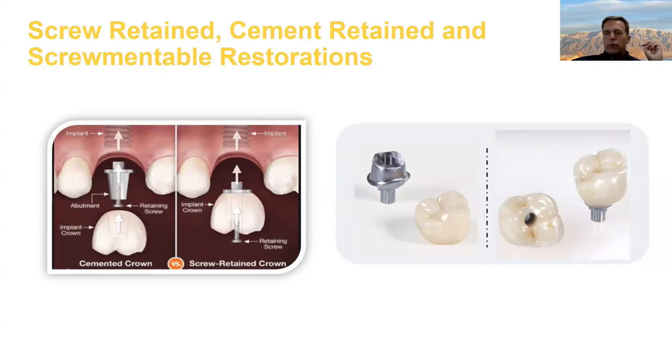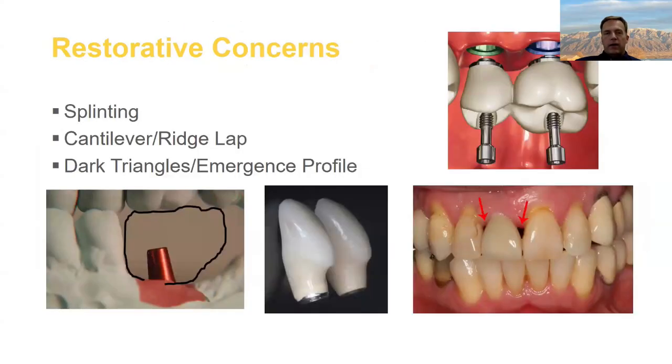As you know, angled screw channel, or angled screw access, whatever term everybody else uses, is becoming more and more prevalent. So that can be a solution, but we want to keep in mind that it's not available with all systems. So you want to think about that when you're choosing your implant system. And it usually requires a different driver, so you want to make sure you have the right driver for that.